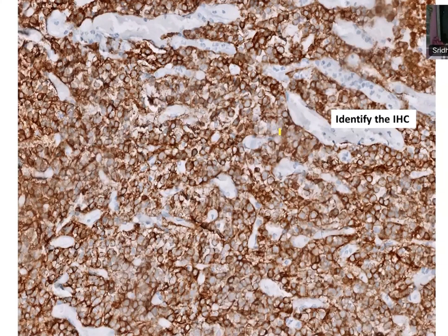Somebody told ependymoma. What is the marker you do for supratentorial ependymoma? Sir, L1CAM. L1CAM, what does it show? Membranous? Yes, sir. Can this be L1CAM? Yes, can be. How many people are saying this can be L1CAM? Does anybody feel that it may not be L1CAM?